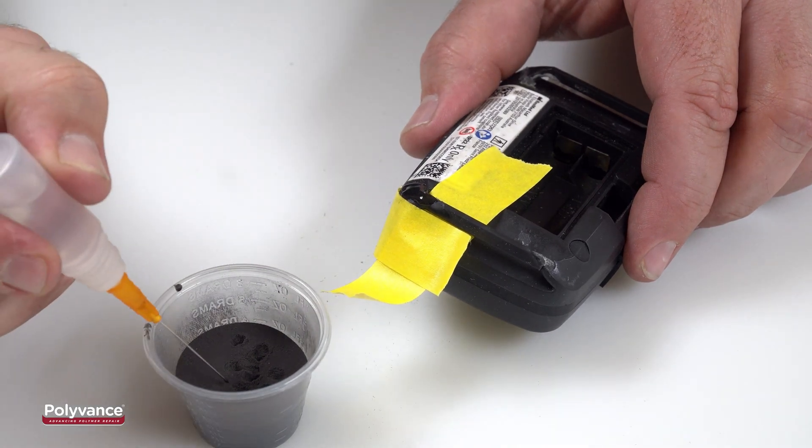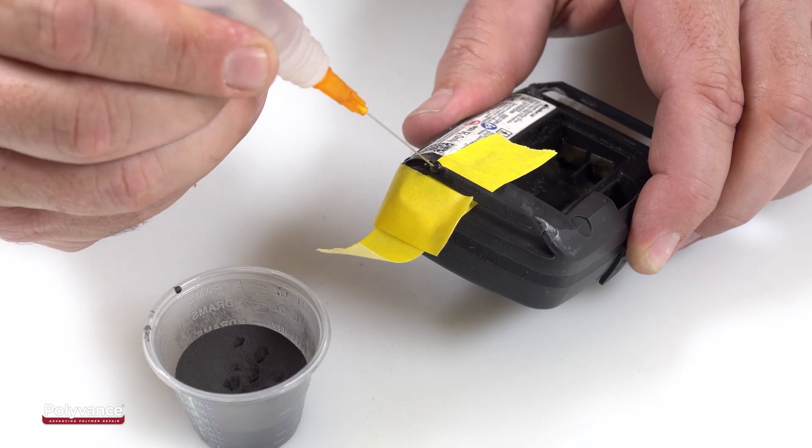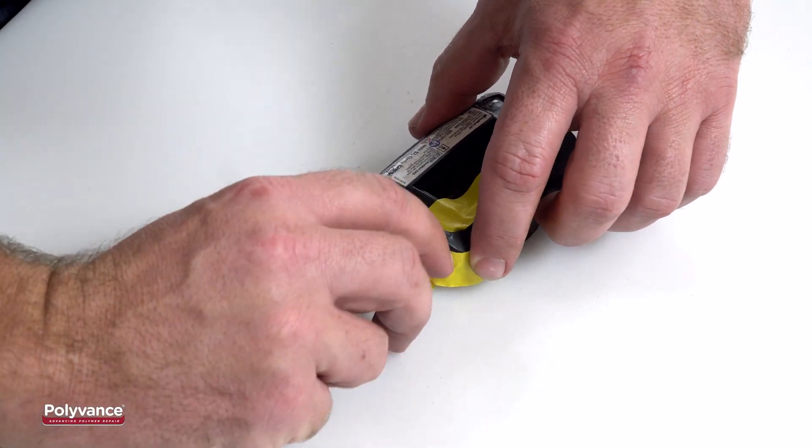Repeat this process until you have applied enough to fill the area. It takes about 45 minutes for the PlastiFix to harden completely. Wait for the repair on the first side to cure before starting work on the other side.